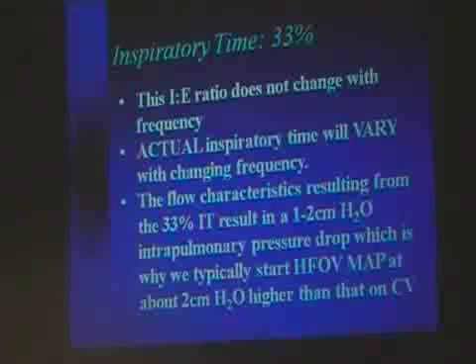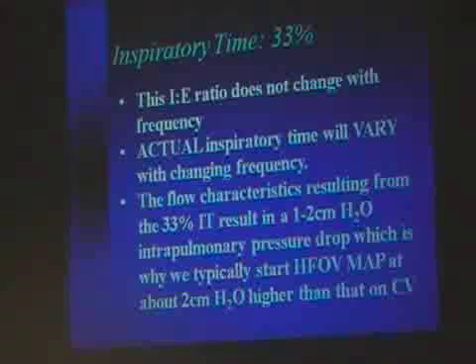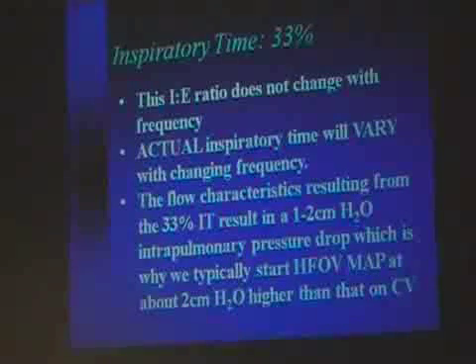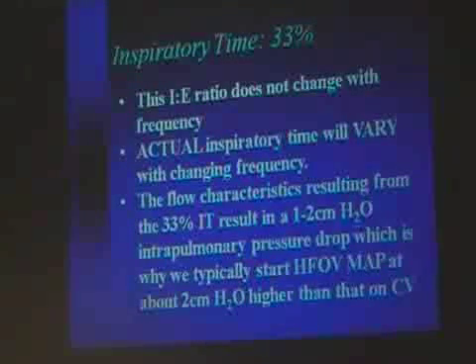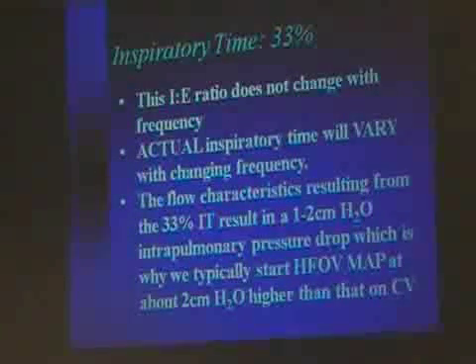Go higher than what you are on conventional, because when you go up by 1 to 2, you are using the same mean. And that may be fine. In fact, most of us do start at the same mean, just so we can get an idea of where we are and where we need to go from there.